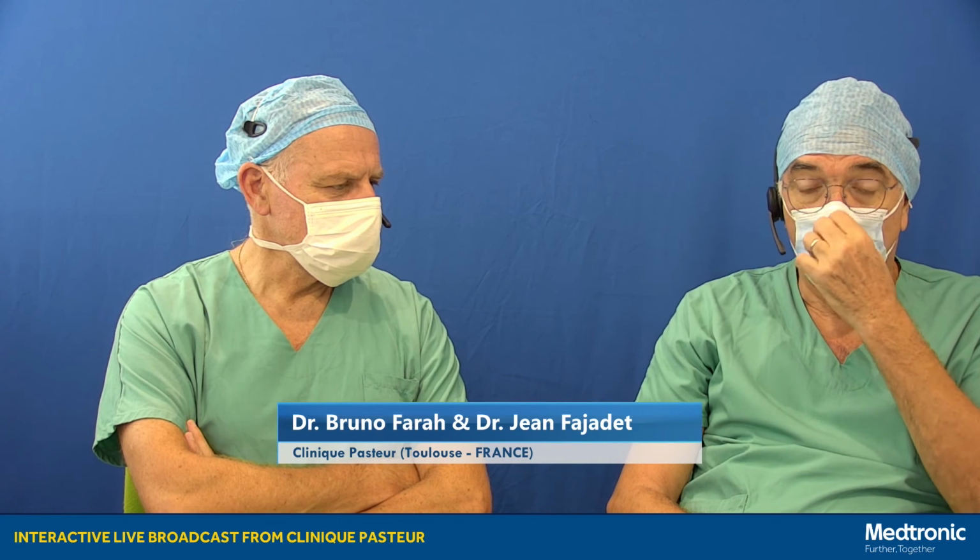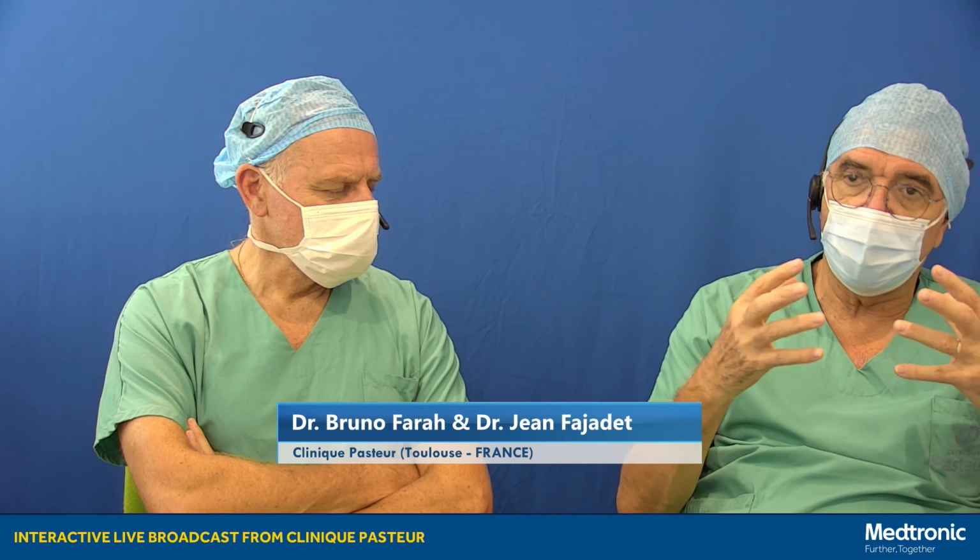The second part was the evaluation of the left main disease. And I was really impressed one more time by the severity of what we saw on the OCT image compared to the initial anatomy on the angio. We saw at the initial anatomy that there was something. We were concerned, and I remember at least 50%, but it was more. It was definitely more.